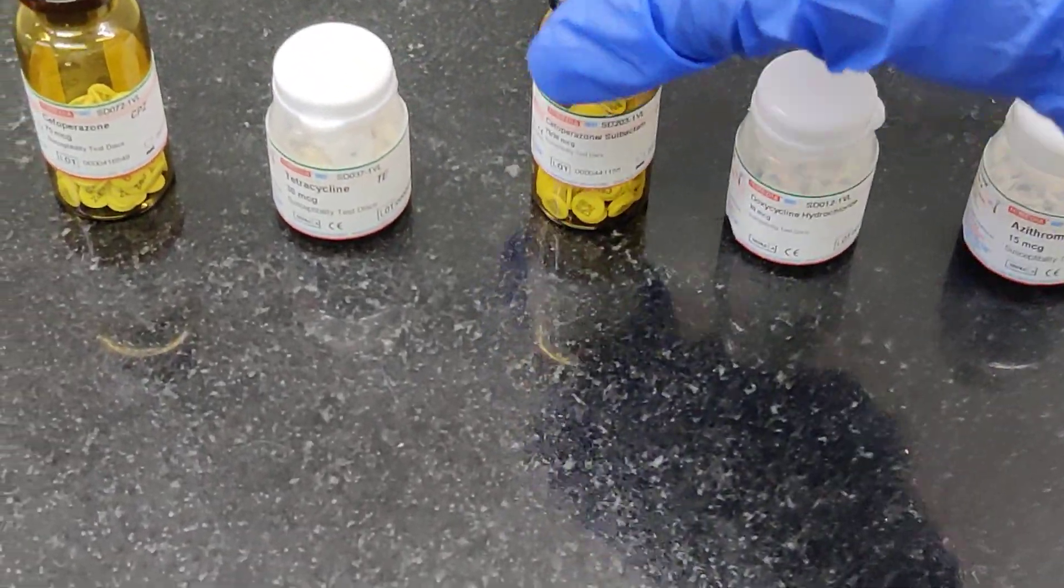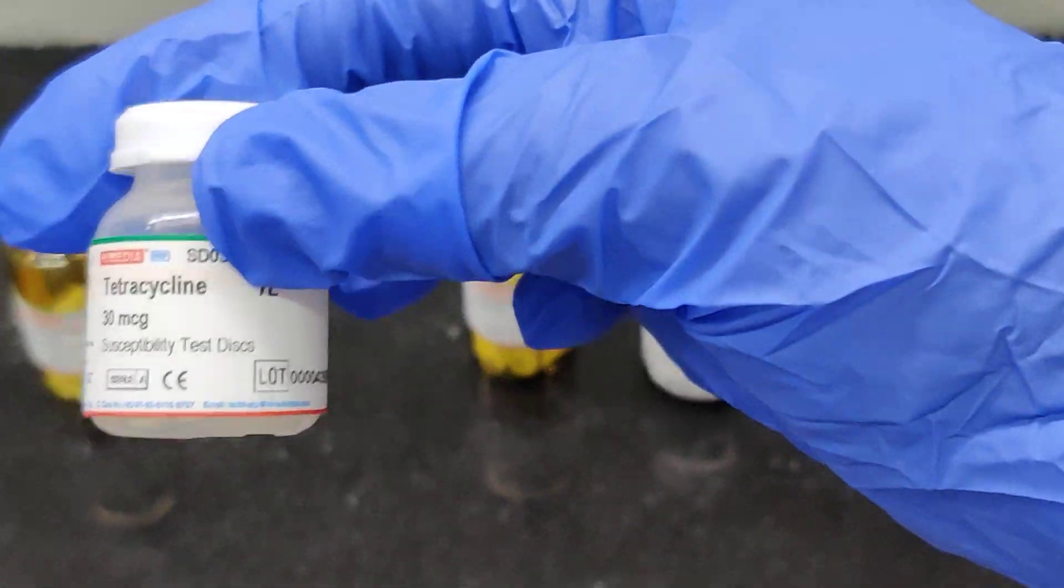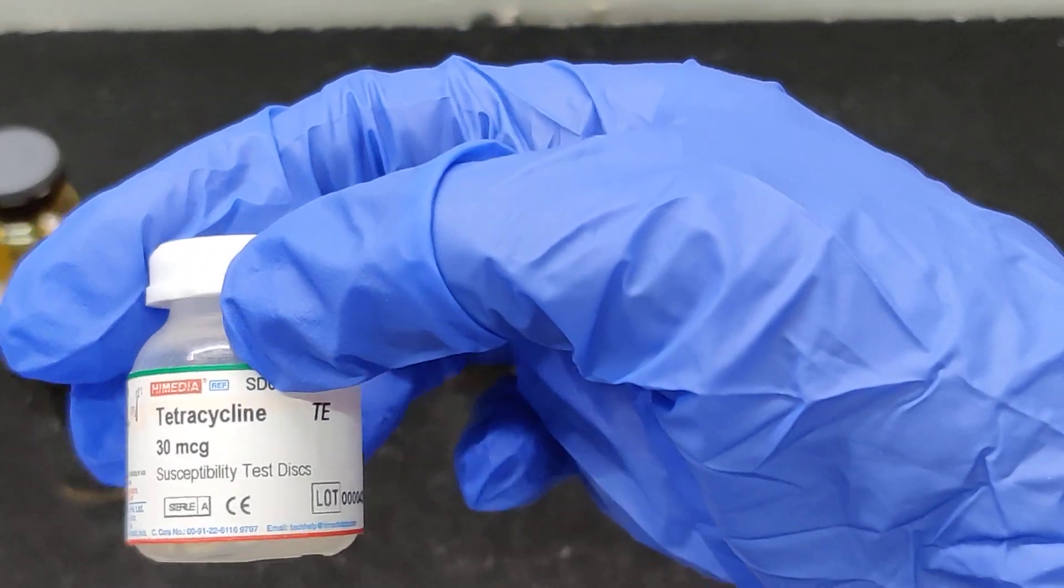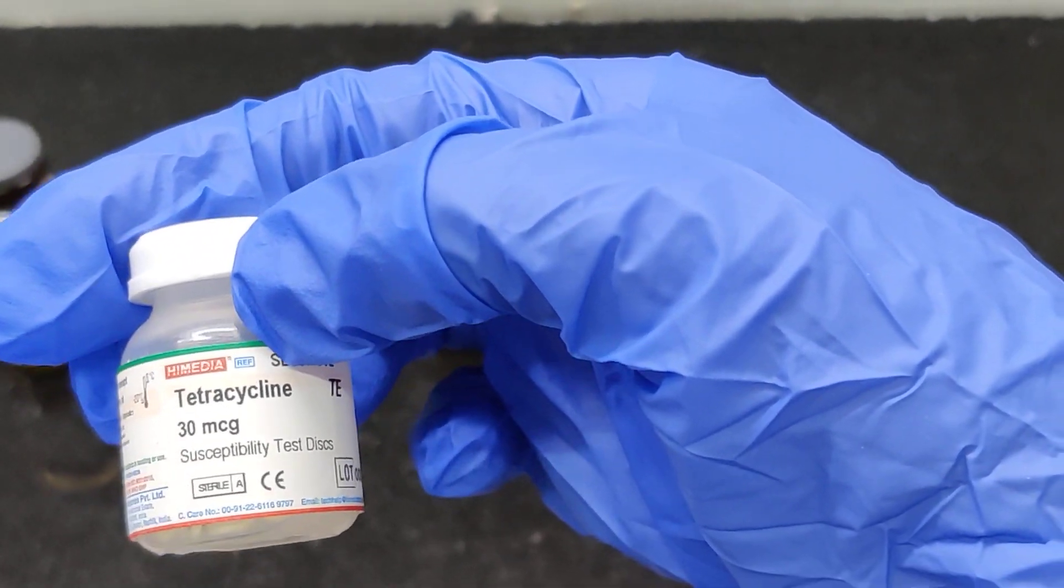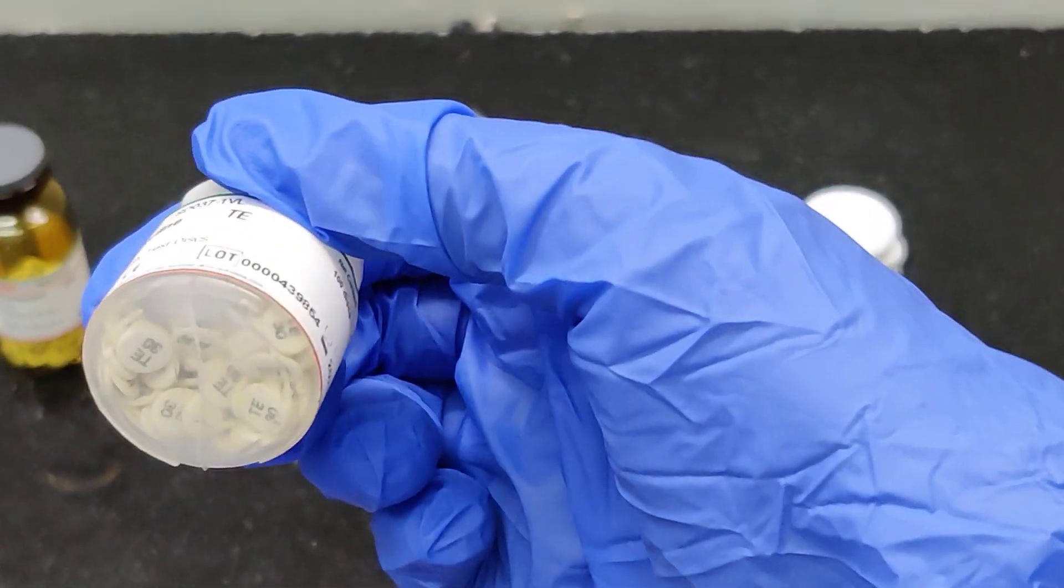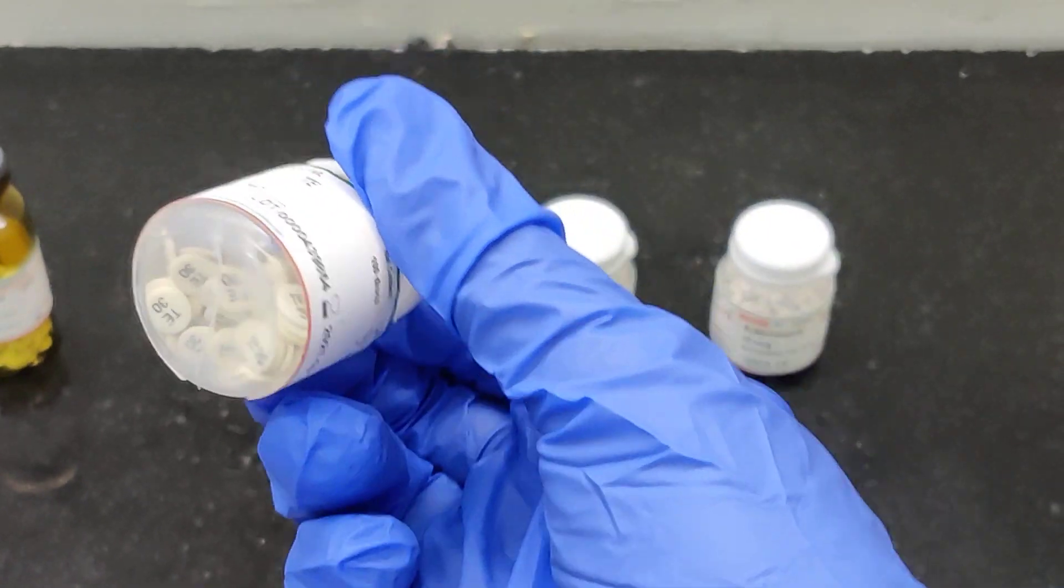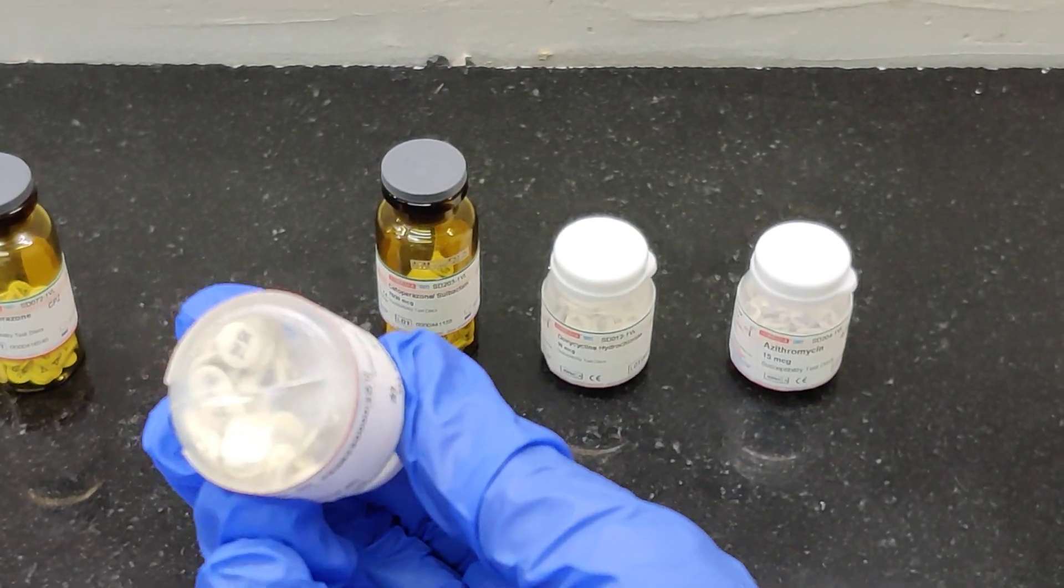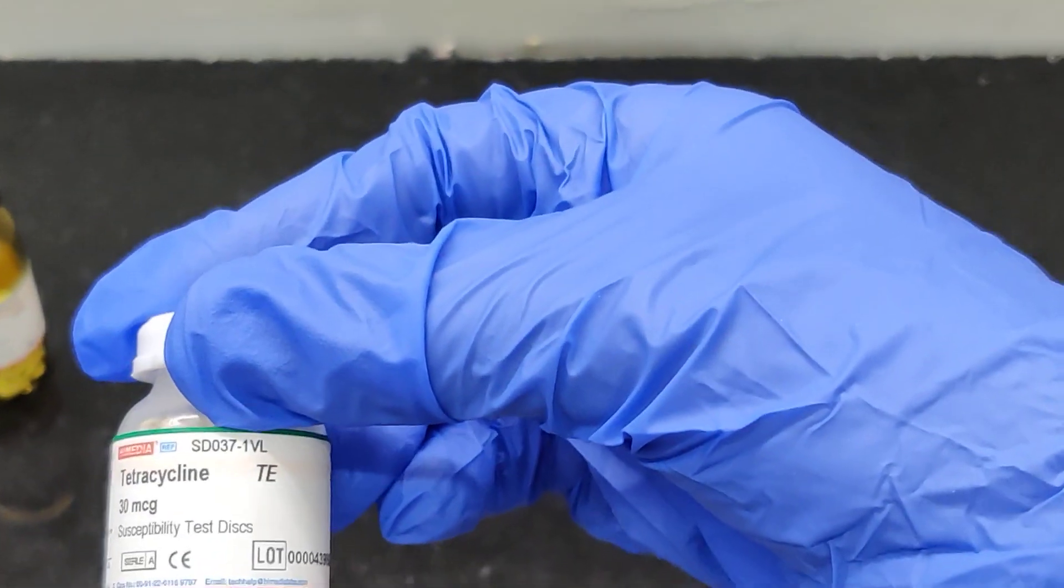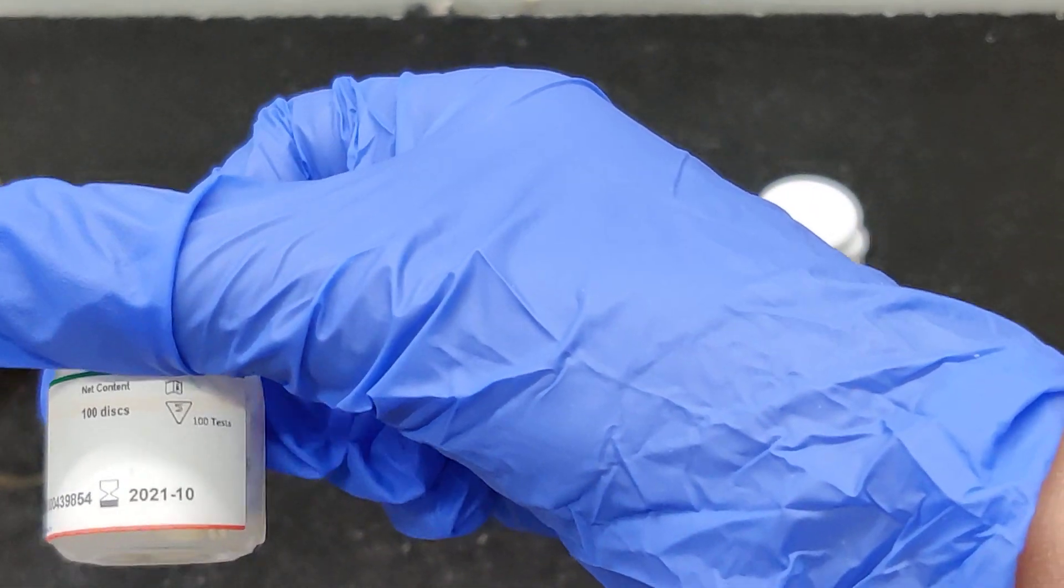This is another bottle of another antibiotic disc, that is tetracycline 30 microgram. TE is the short form. Every disc is going to be engraved with the short form TE, as you can see here, along with the number 30, which represents the quantity of the antibiotic.